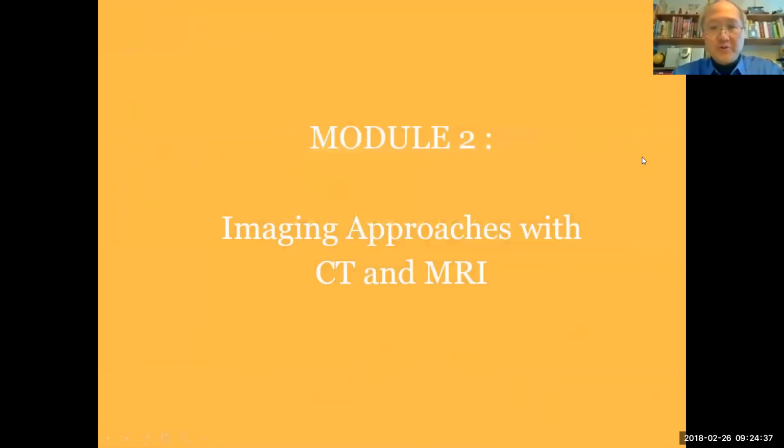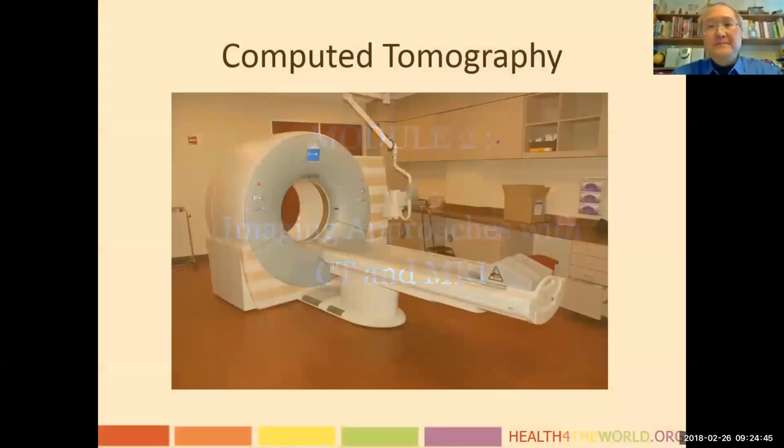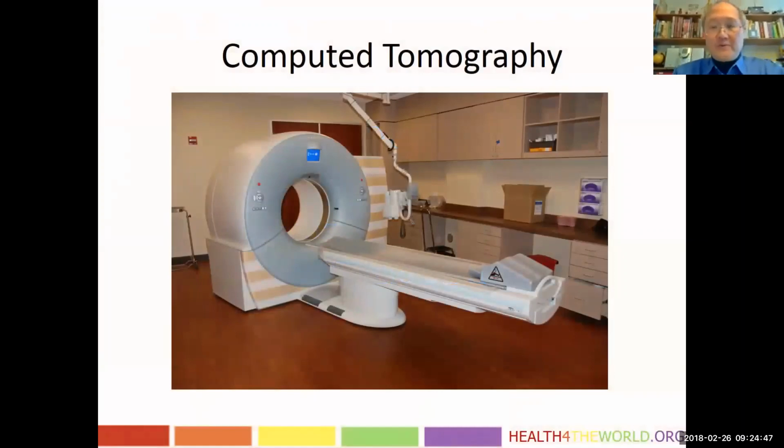On to module number 2. We're going to talk about imaging approaches with CT and MRI. We'll first talk about computed tomography.